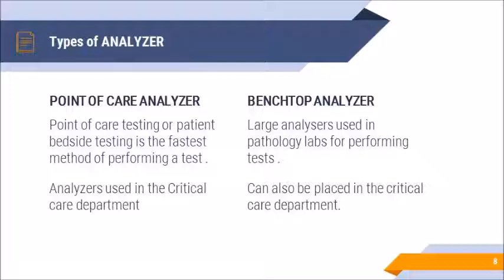So the faster the patient test is done, the faster the results are provided, the faster the decision making, and the faster the patient is weaned off the ventilators in the critical care department.